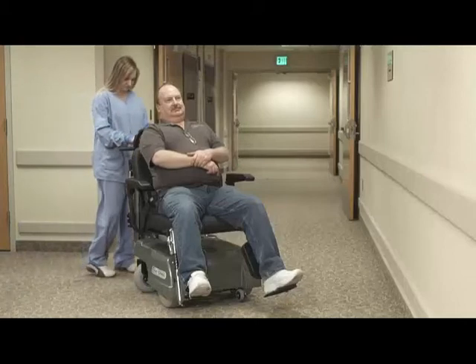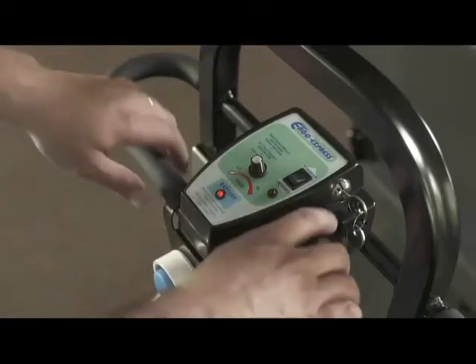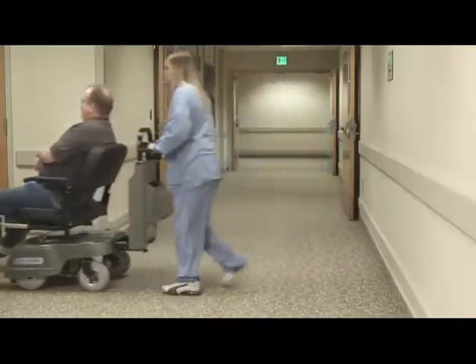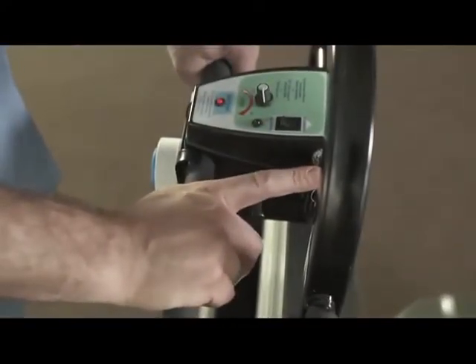Second, familiarize yourself with the handle controls. The two throttle levers next to the handlebars are used to control the speed of the drive motor. When either is squeezed, the PTC will move in the direction determined by the reverse indicator lamp. The brake system engages automatically when the power is on and the speed controls are not depressed.